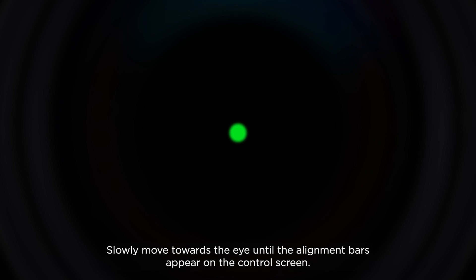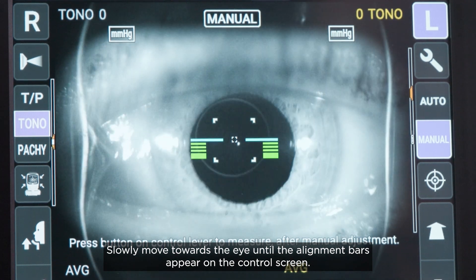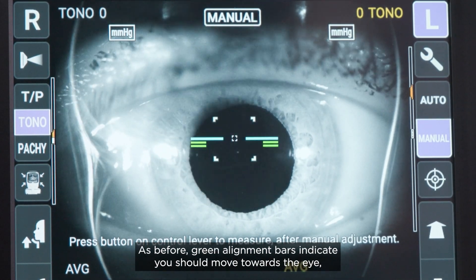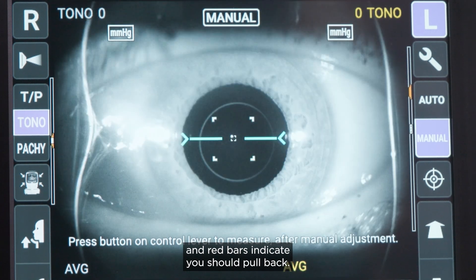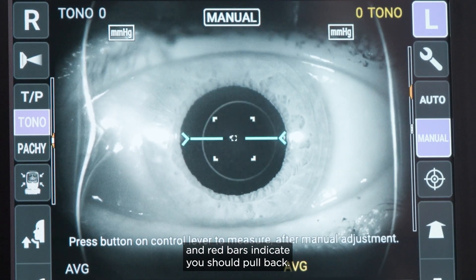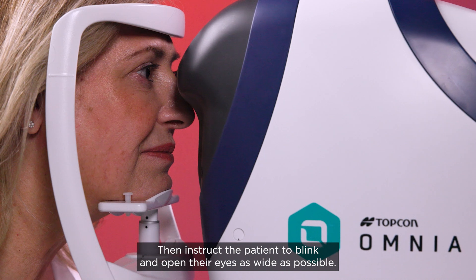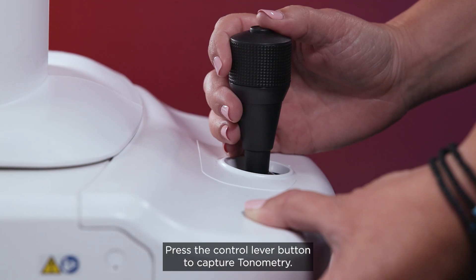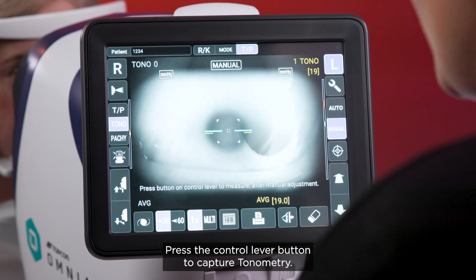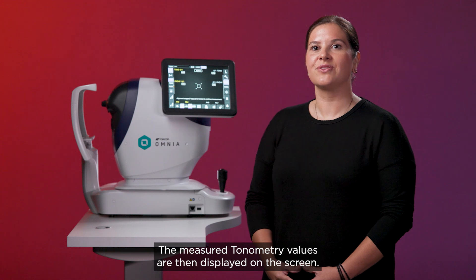Slowly move towards the eye until the alignment bars appear on the control screen. As before, green alignment bars indicate you should move towards the eye and red bars indicate you should pull back. When ready to measure is displayed, instruct the patient to blink and open their eyes as wide as possible. Press the control lever button to capture tonometry. The measured tonometry values are then displayed on the screen.